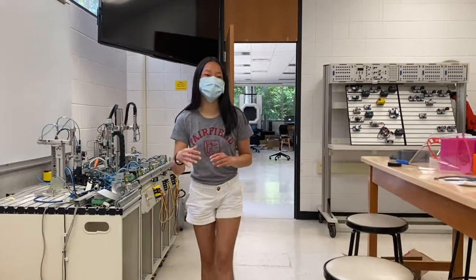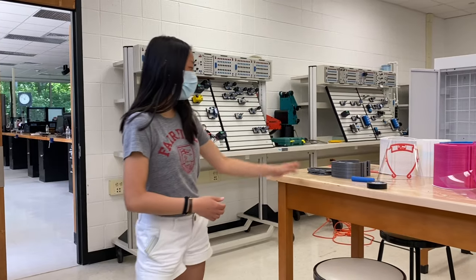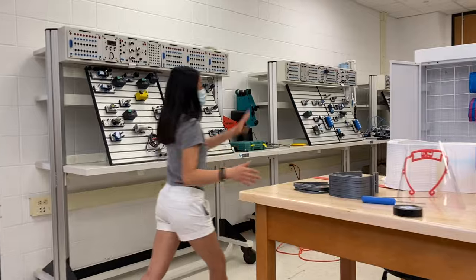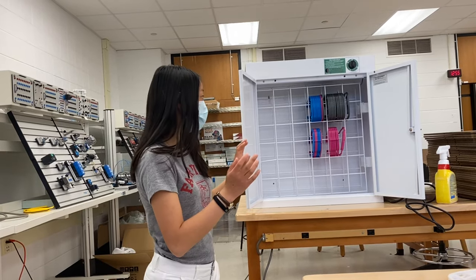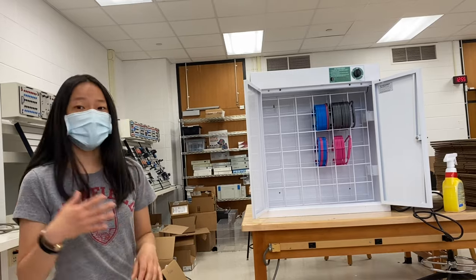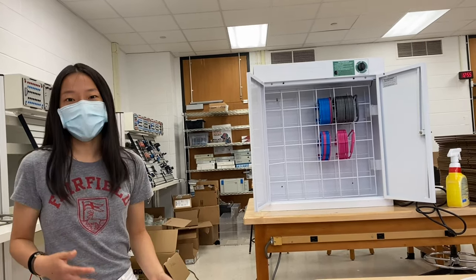Once the shields are taken off of the printers, Drew, Evan, or Tom are usually in charge of taking the stacks and breaking them apart. And then once they're broken apart, we put them in these sanitation cabinets. These sanitation cabinets were donated to us by Fairfield Prep. We'll usually put the headband in here for about 15 minutes or so, and that just gives us an extra layer of sanitation before they go out to be packaged.